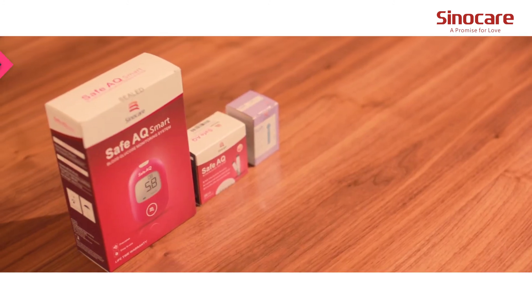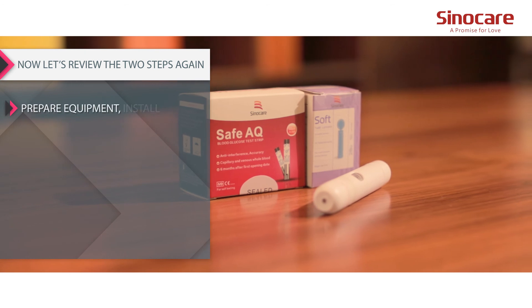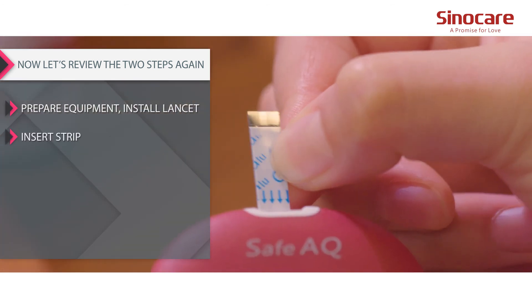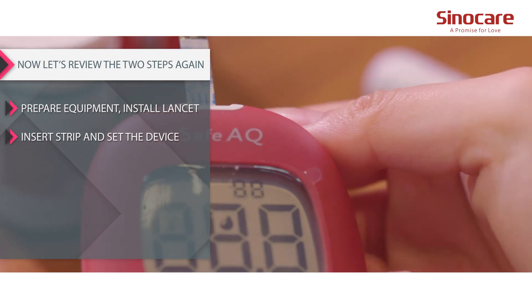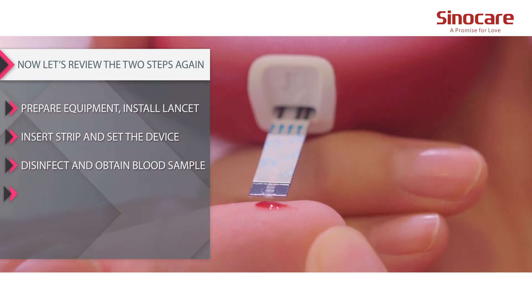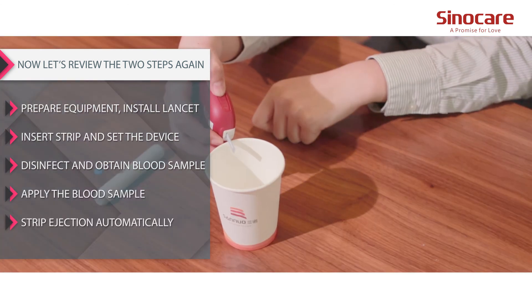Now let's review the steps again: prepare equipment, install lancet, insert strip and set the device, disinfect and obtain blood sample, apply the blood sample, and strip ejection automatically.